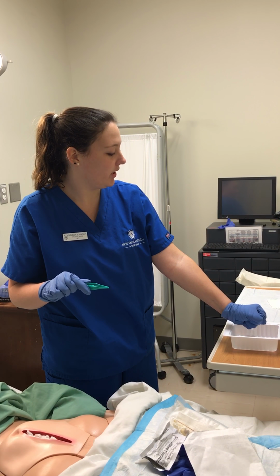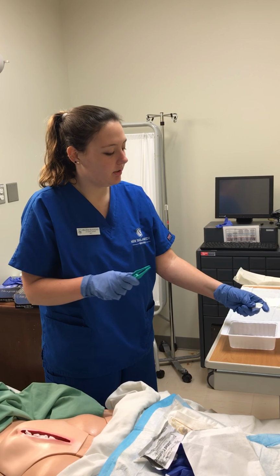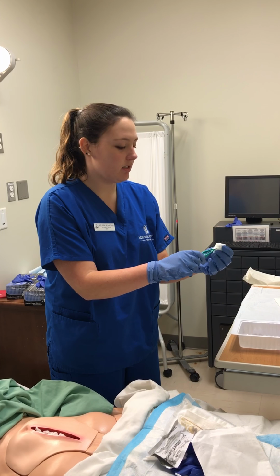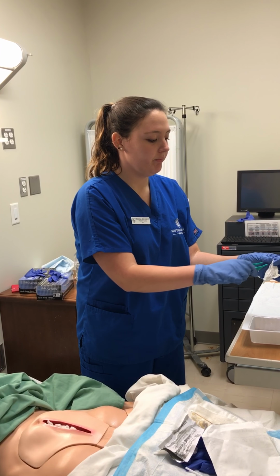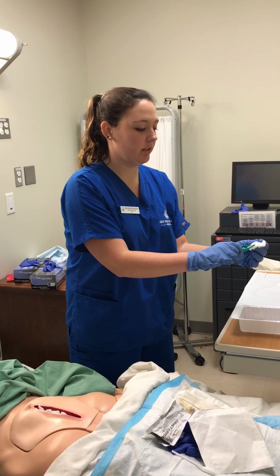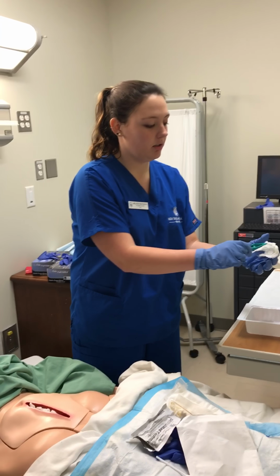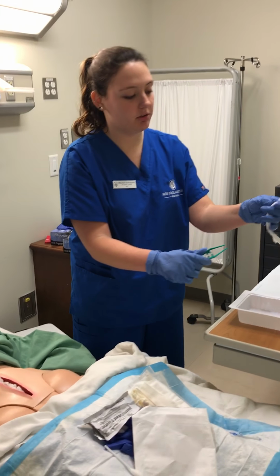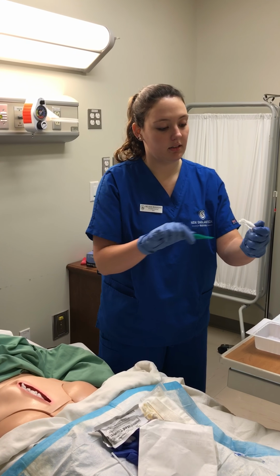Once again, draining the excess water, and then I'm going to fluff it out. I like to keep a distance from my tray in my sterile field because this can be kind of a messy task depending on how much saline you put into the tray. Okay, once again, careful not to touch the forceps to my hand or my clean hand.